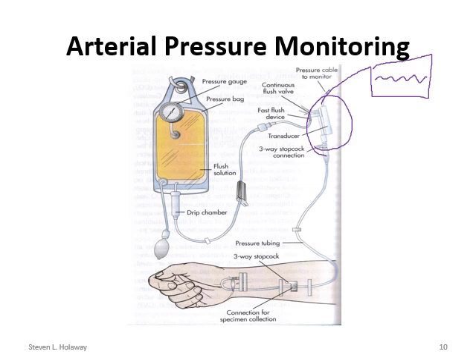The other portion that we're going to look at is a pressure bag. This pressure bag is typically normal saline, and it can be 250, 500, 1,000, depending on the policies at the institution you're working. This is a flush solution. This is to keep this line patent. It's very similar to when we used to do saline locks, but basically it's keeping that line open.